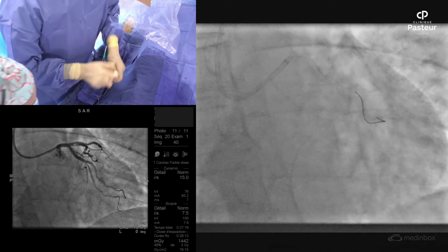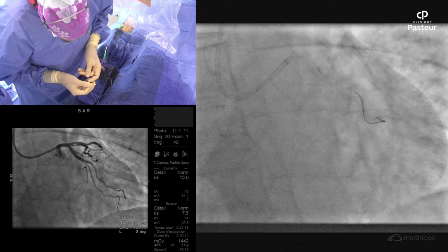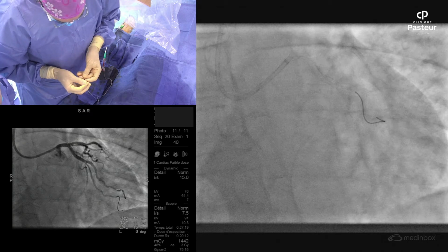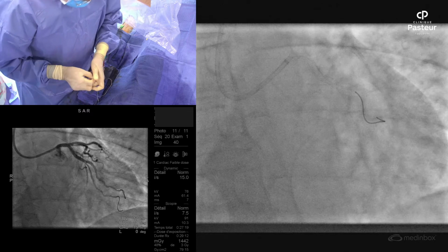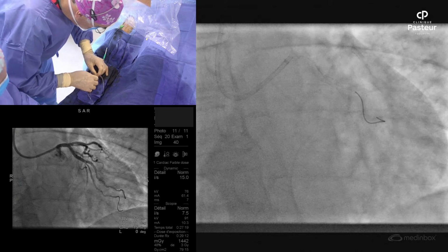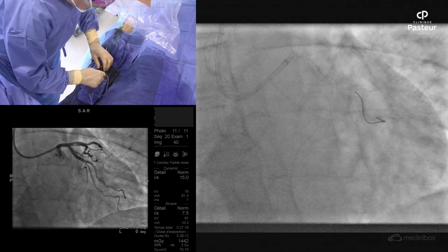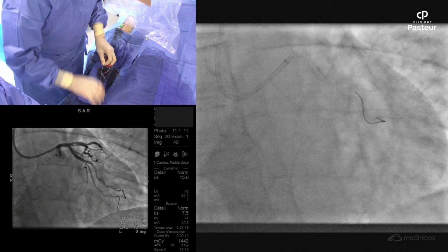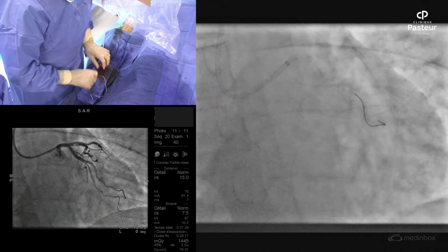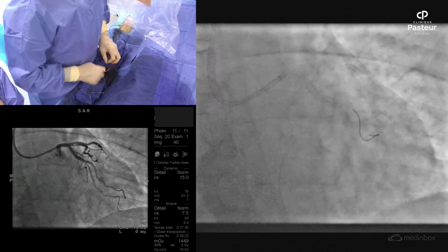It's the same balloon. It was already inflated one time, and it was a 3.0 NC balloon. So the profile of the 3.0 NC already opened 2 times at high pressure is, of course, a little bit more difficult to cross. So with my fingers, I try to reshape it. During this time, the nurse placed negative pressure in the deflator, and we will try. If not, we will take a new one. But again, we need to finish by the proximal balloon inflation, the final POT.